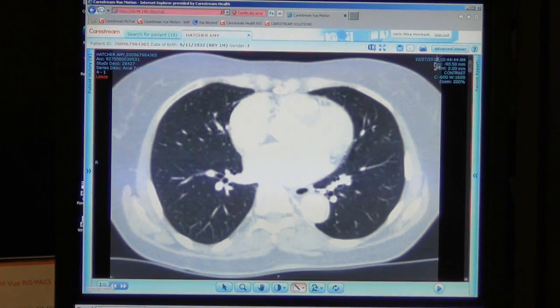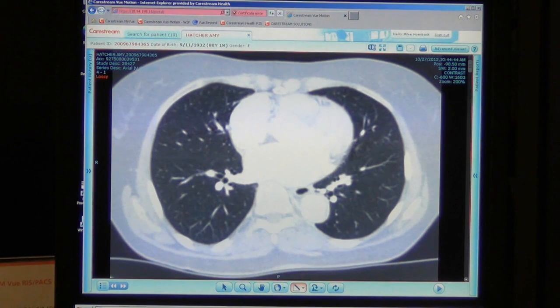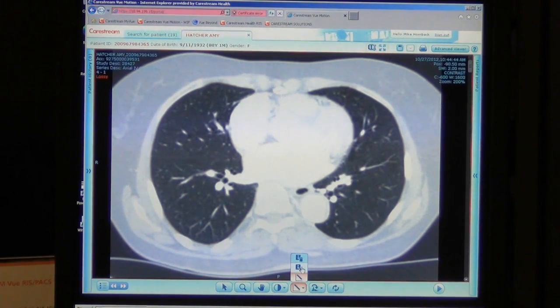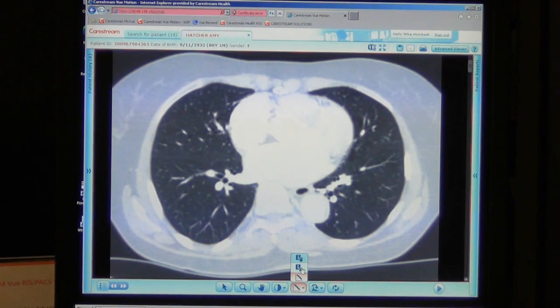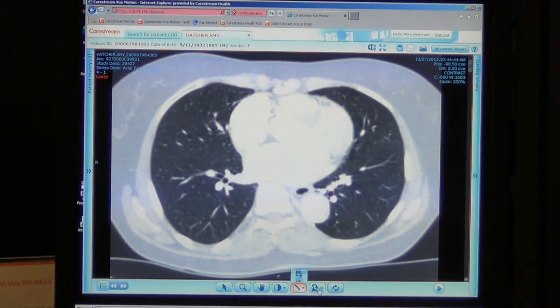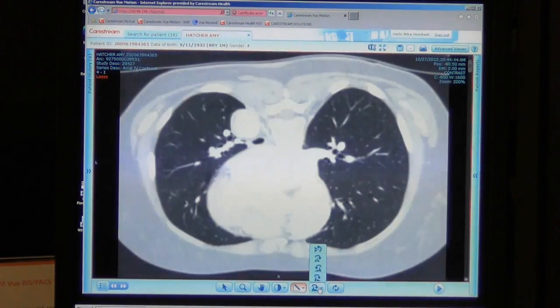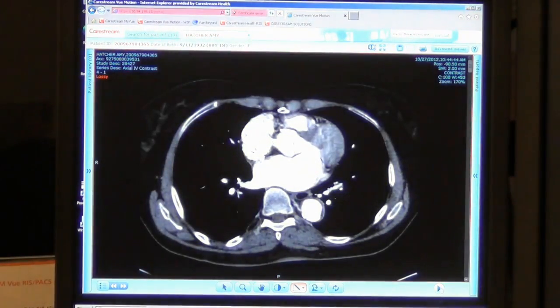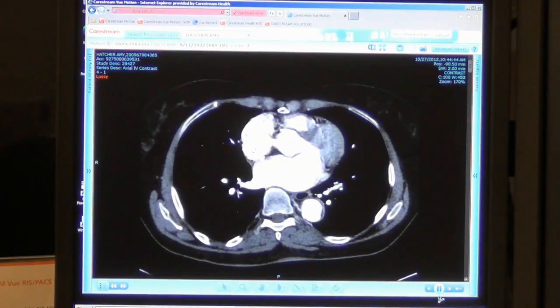Notice my DICOM header is at the top of each corner of the screen. I can also anonymize the study by hiding those. I can flip the image, reset it, or play cine mode.